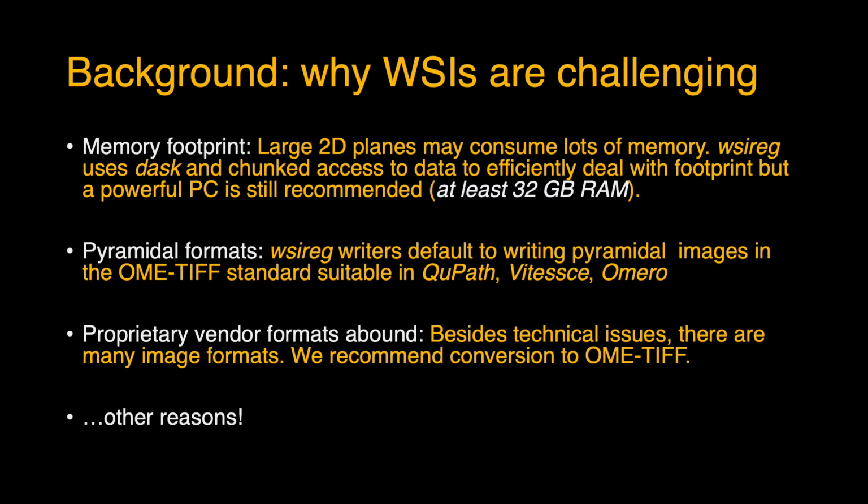Another aspect of this is a lot of standard images will just have one resolution layer, the base layer, so to speak. However, most whole slide images have a pyramidal structure, so that when you're visualizing the data, you only load into memory the portions that you actually need. So when you're zoomed out, you're really looking at a thumbnail of that data.